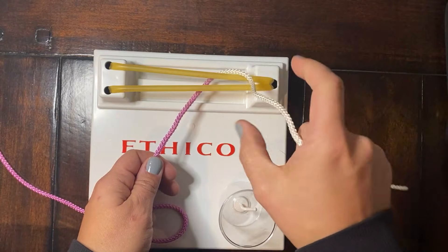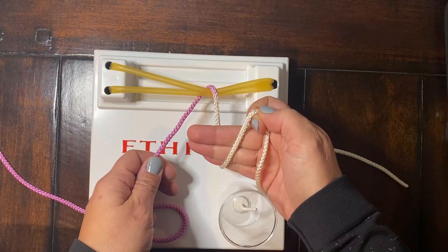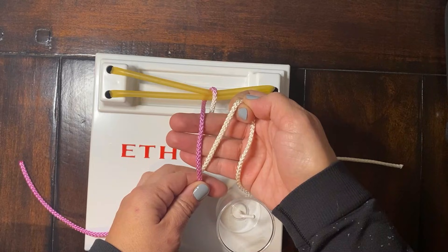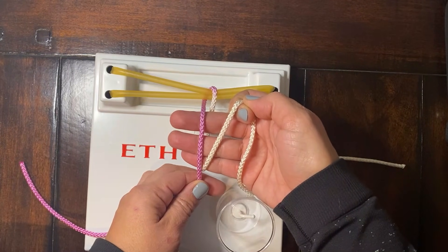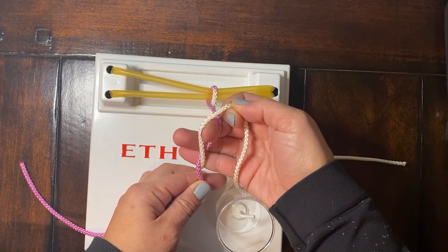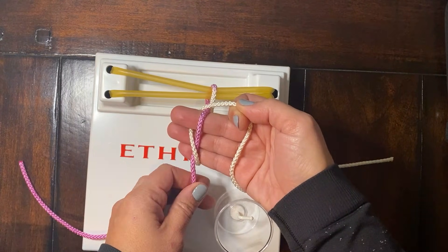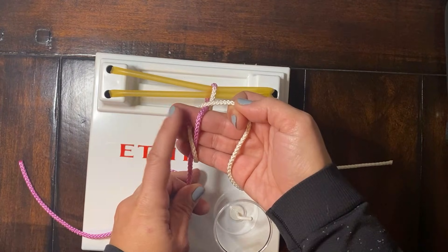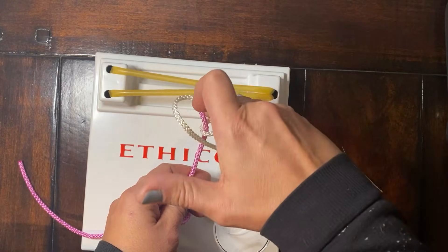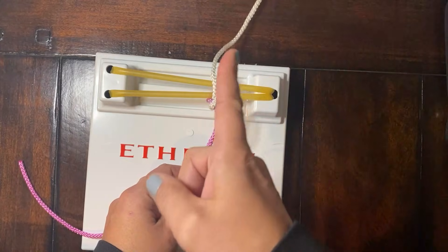So we start here, pinch the suture above, crossing down to chop the suture. Then we'll lay our second strand right over those three fingers. We're going to rely mostly on the middle finger to do this work. We're going to come over the purple strand, under the white strand, to play a little cat's cradle. We're going to pinch this white suture, the free end, between your middle finger and your index finger. So we're going to let go here and rotate the hand down. You'll end up pulling the free end through and away from you.